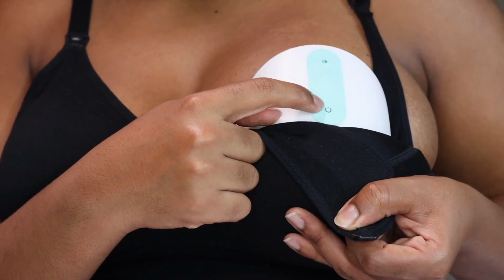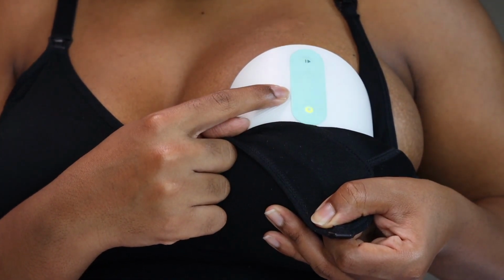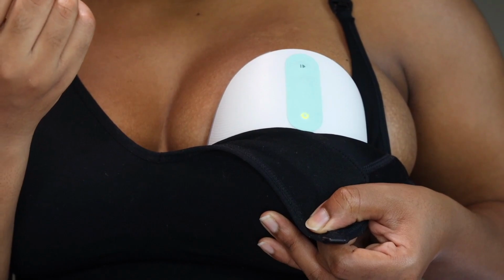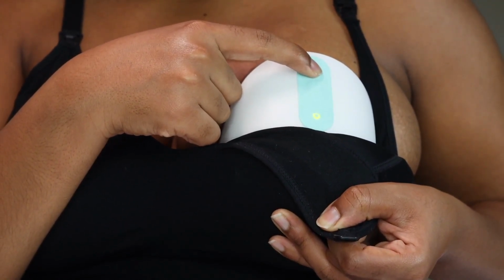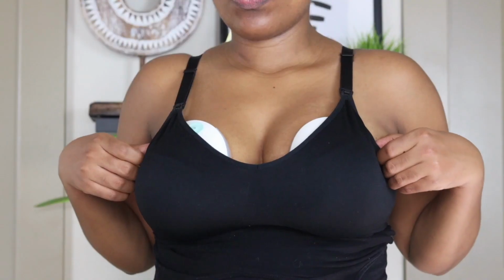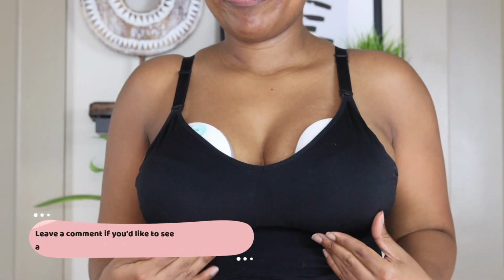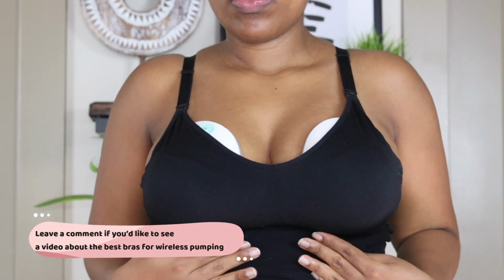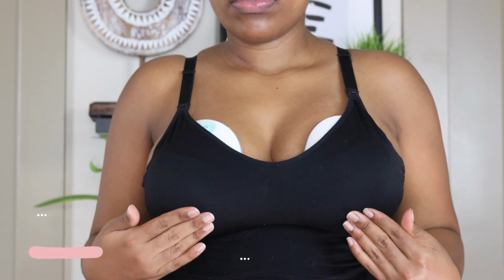So now that the pump is assembled, we will go ahead and start extracting the milk. So of course you press the power button as well as the play button and get to pumping, honey. You want to make sure you have on a really good breastfeeding bra that's secure to hold the pumps up, because without that, it's going to be very difficult for the pumps to extract the milk.